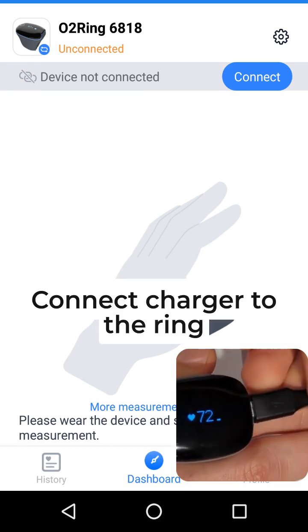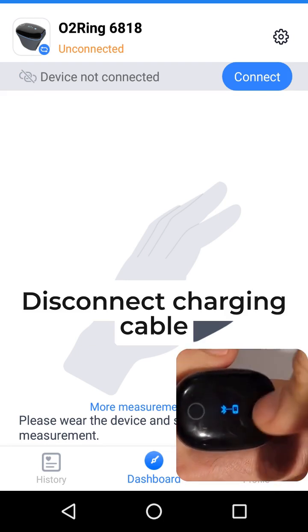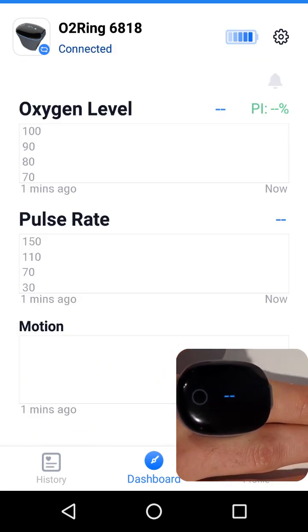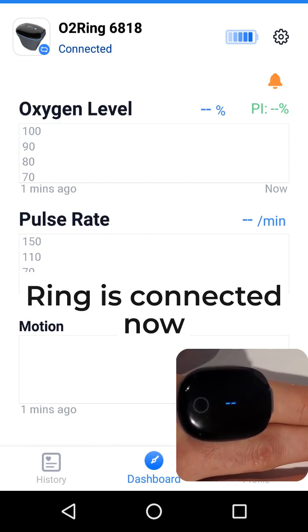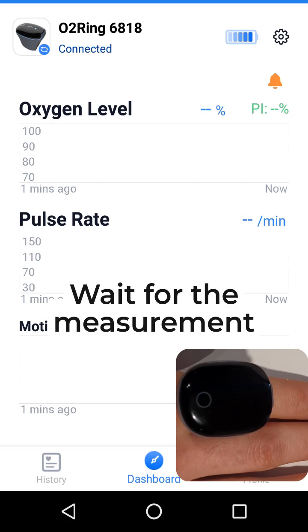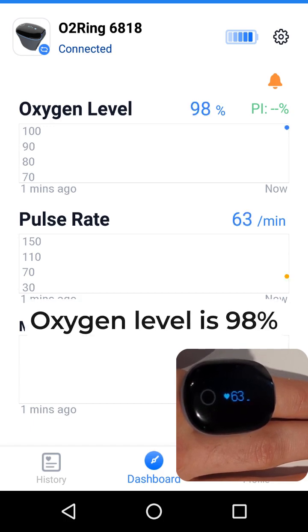Connect the charger to the ring, then disconnect the charging cable. The ring is connected now. Wait for the measurement to make sure it works — it works. Oxygen level is 98%.